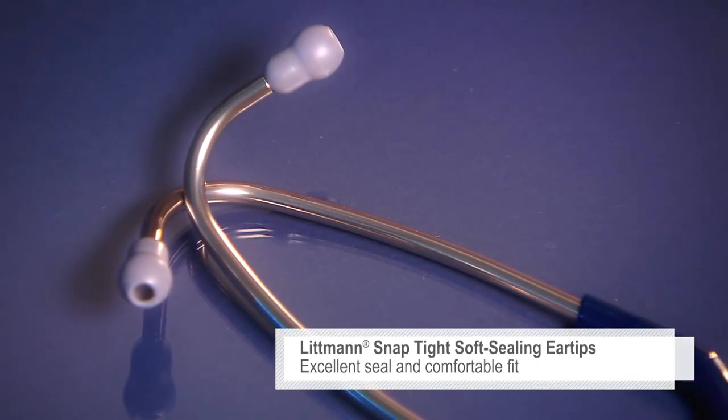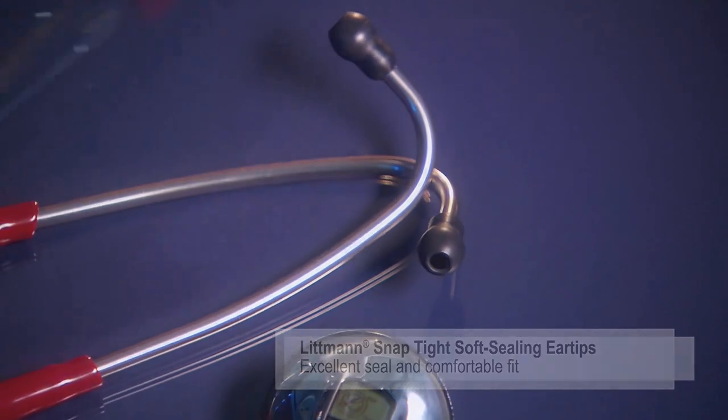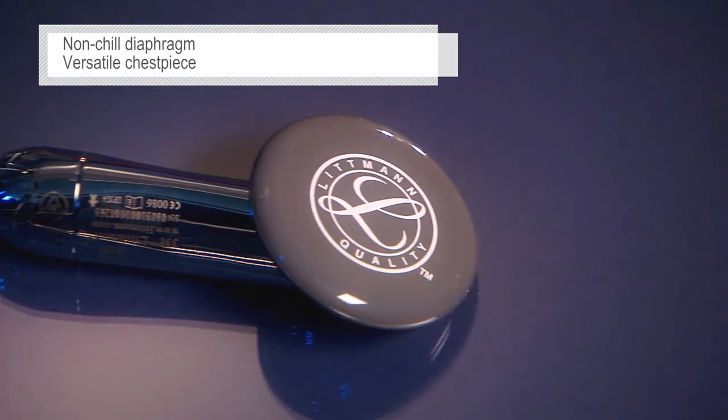Our soft seal ear tips and traditional headset further enhance their comfort hour after hour. Both models feature a non-chill diaphragm and versatile chest piece, so they're also comfortable with infants and pediatric patients.